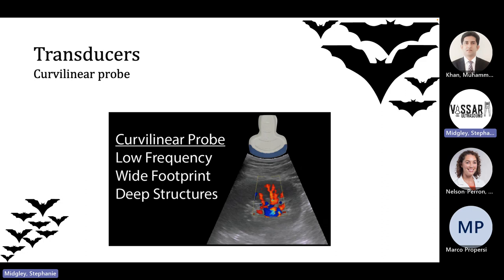Curvilinear is just like it says. It has a curve to that footprint. Again, it's going to give you a wider footprint. And it gives you a bit of a better shallow resolution, but also lets you see deep.